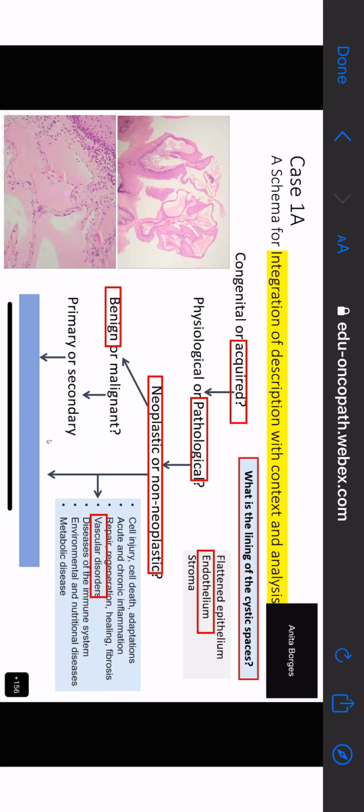Lymphangioma. But there is a particular kind of lymphangioma that is seen above the surface and associated with squamous epithelium as a rule. So what is that called? Ma'am, lymphangioma circumscriptum. There you are. So it is circumscribed. There are dilated lymphatic spaces, and so this is lymphangioma circumscriptum. Very good. You all arrived at the diagnosis in good order.